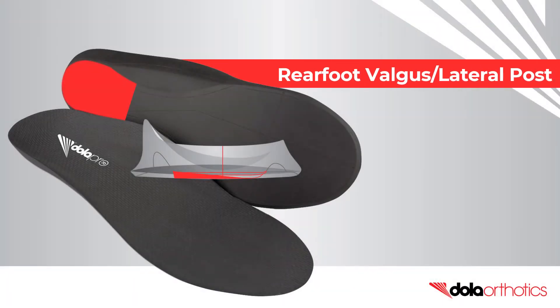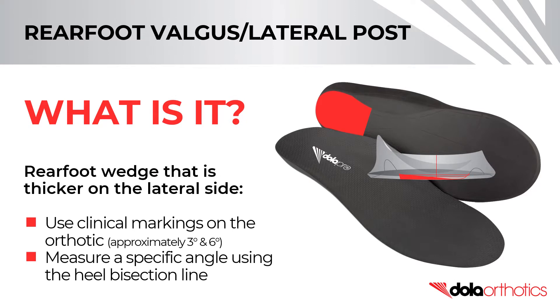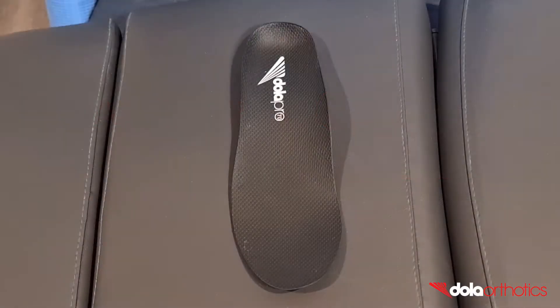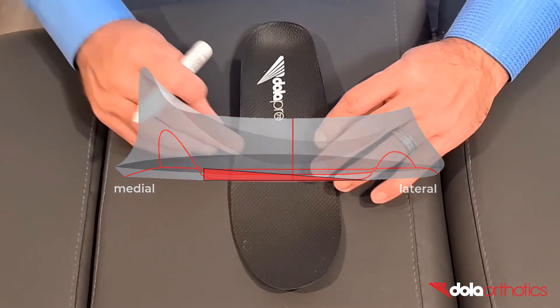How to modify a full-length Dollar Pro orthotic with a rear foot valgus or lateral post intrinsic grind. A rear foot valgus post is a rear foot wedge that is thicker on the lateral side. Common grinds include to the rear foot post clinical markings or measured to a specific angle using the heel bisection line. In this video we will show you how to complete a six degree intrinsic rear foot valgus grind on a full-length Dollar Pro orthotic.